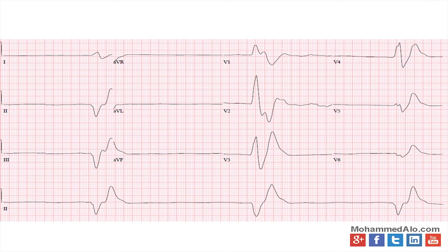Next one is your why-on-earth-are-you-doing-this-EKG-and-not-doing-chest-compressions EKG. This guy is absolutely bradycardic, sine wave pattern. This is when you're hyperkalemic and your potassium's like 9 or 10. This is a horrible EKG to have.